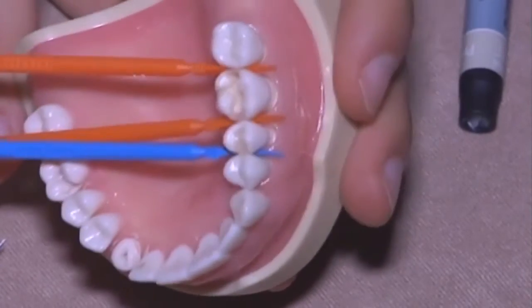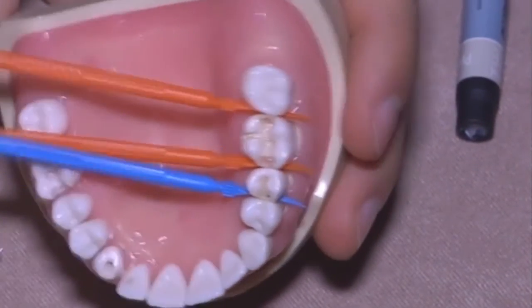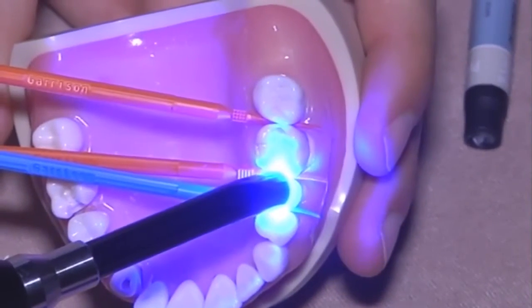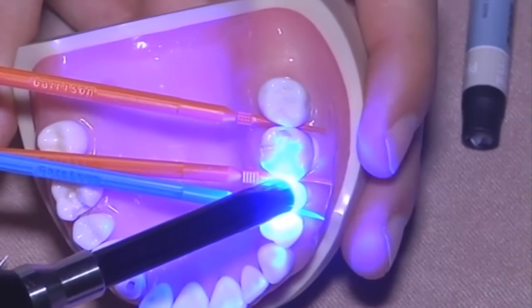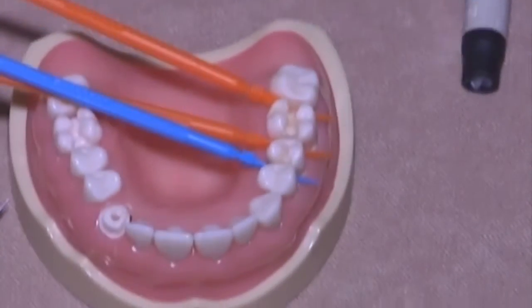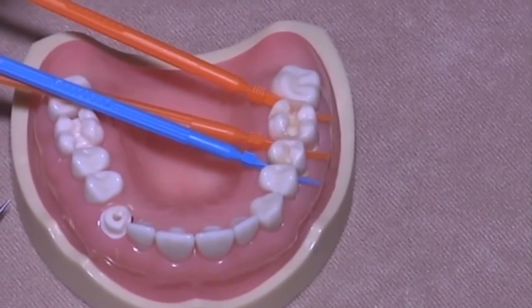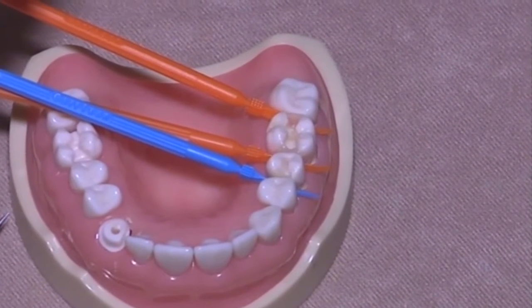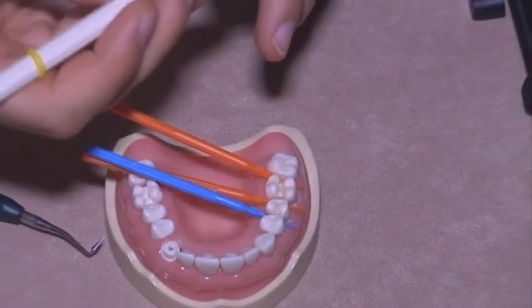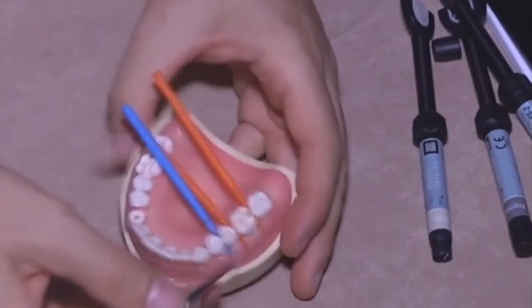Once you check that the direction and the inclination are correct, light cure. This is a really small cavity with 2 layers. We will complete it. You can perform your restoration on the other side.